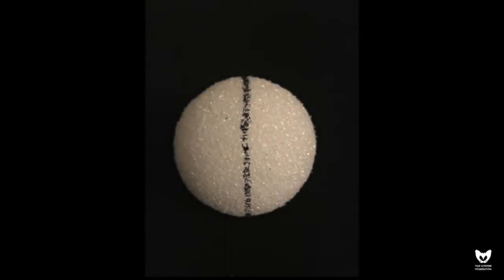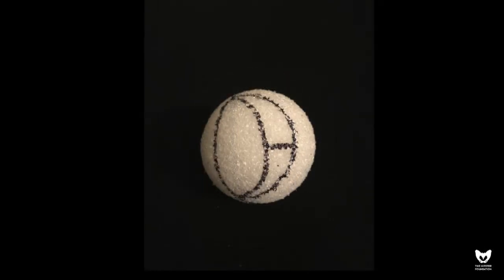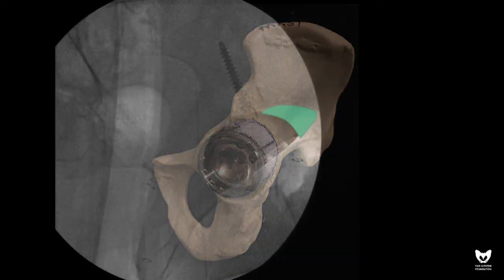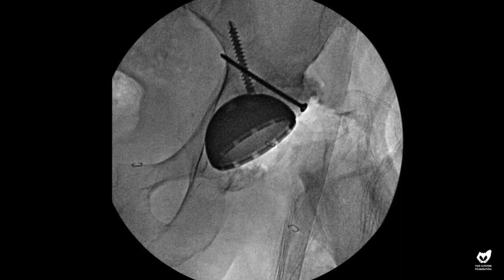We then turn our attention to the femoral head. A reamer or trial acetabular component is used to identify the section of the femoral head that needs to be taken. This takes a little three-dimensional thought — we're looking at it like a lemon wedge and trimming it to fit the defect. Once the bone graft is provisionally in place, we tamp it into position, thereby loading the graft, and secure it with one or sometimes two 3.5 fully threaded cortical screws.